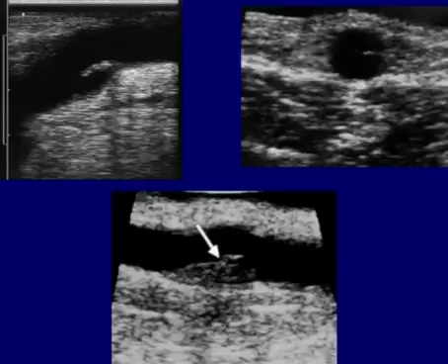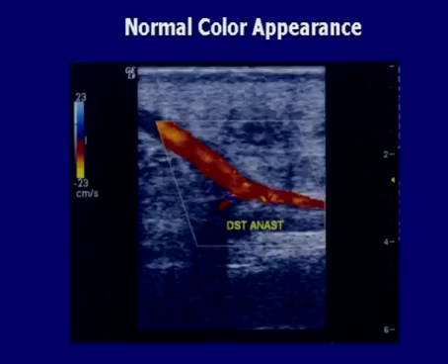It looks pretty intact, and behind this leaflet, we've seen some thrombus laid down. So again, we need to find these and follow these. Not every one of these may create a hemodynamically significant stenosis, but we need to locate them and monitor them. Color flow imaging, just as we use it in the native vessels, can be used as an adjunct when we're scanning bypass grafts. We want to see the color filling out to the vessel walls, look for uniform, smooth color.